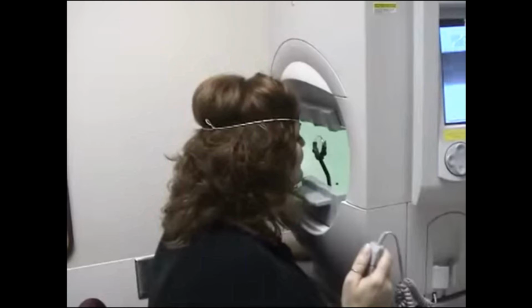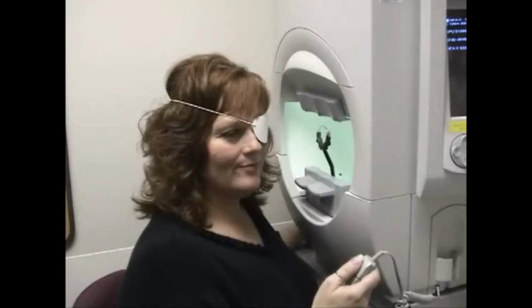If you want a sensitive and quantitative assessment of visual field loss, you must go to formal testing, also known as perimetry. The main drawback of perimetry is that it requires expensive equipment and attentive patients. Here is how it goes.